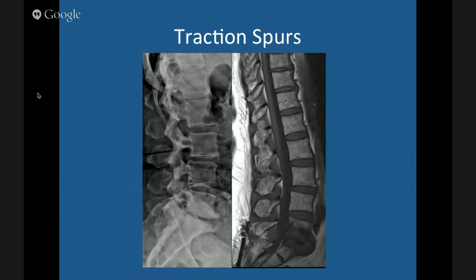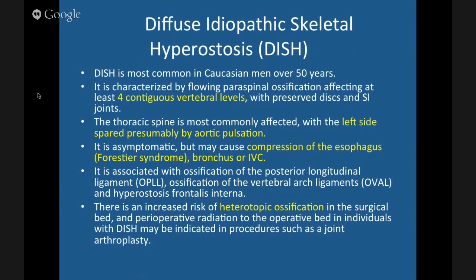Here's another example of a big traction claw — a traction osteophyte. See the end plate? This is a degenerative disc on MRI. There's subchondral sclerosis and the osteophyte or bone forms far away from the end plate. That's a traction spur.